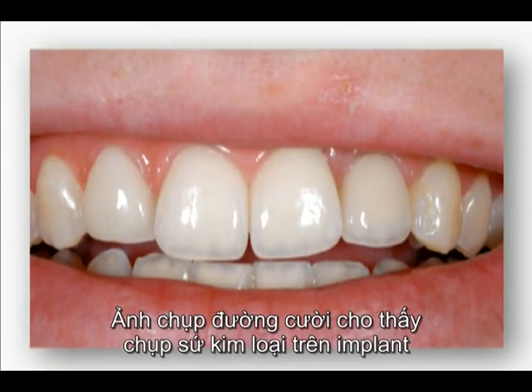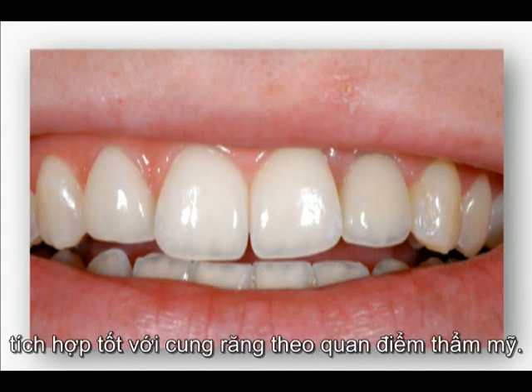The lip line view shows that the implant-supported ceramo metal crown is well integrated in the dental arch from an aesthetic point of view.